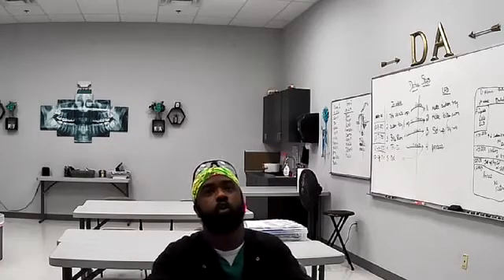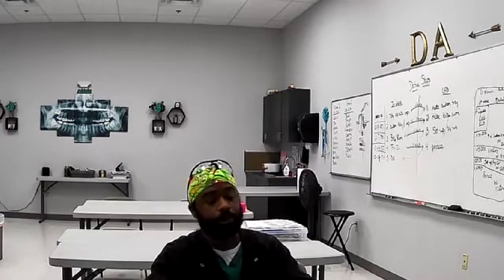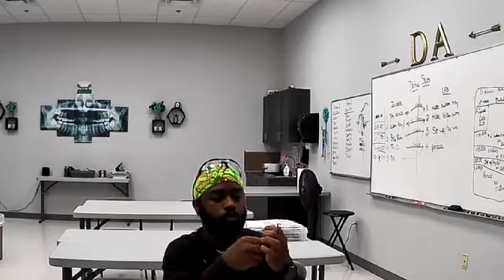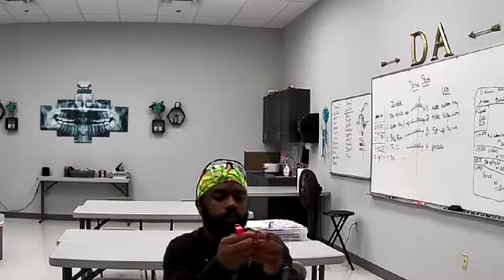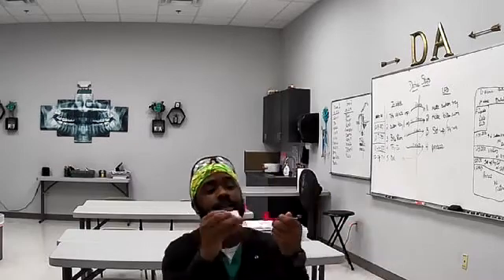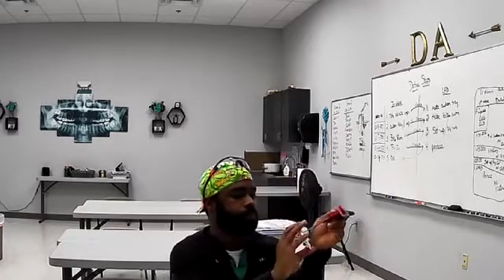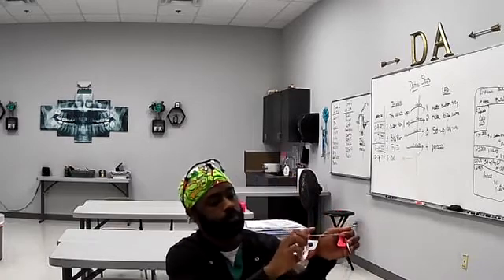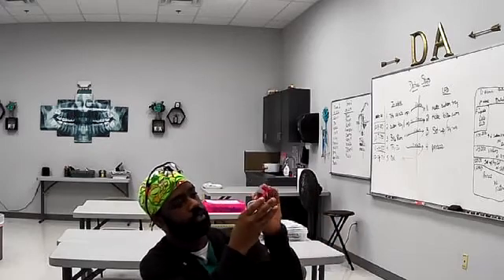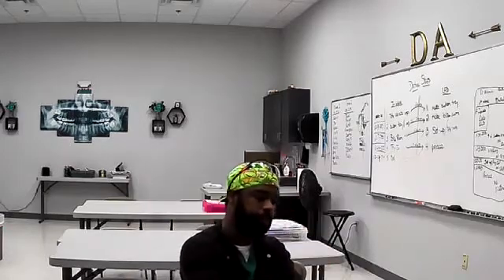All right. So first we're going to talk about bite wings. Bite wings are the red. Remember? So we'll pretend like this is your sensor. You put the sensor in there, and then that way you can look straight through and you see the actual sensor.